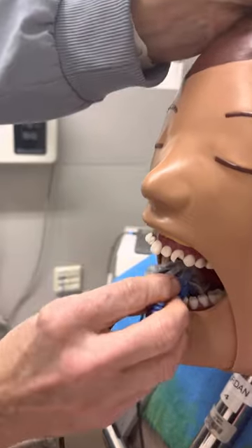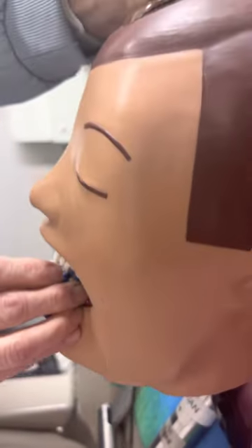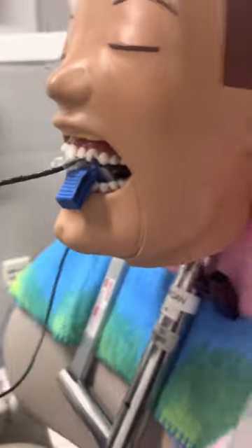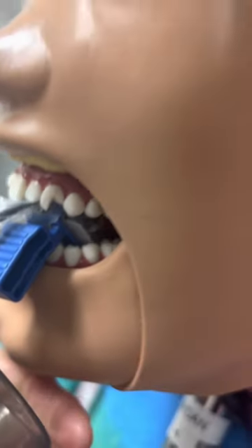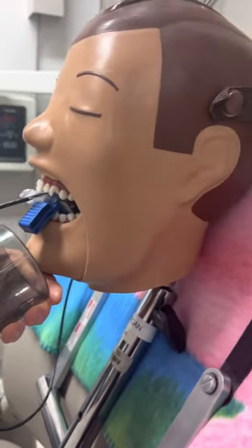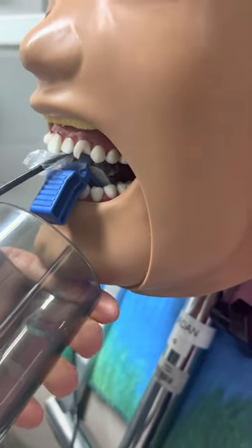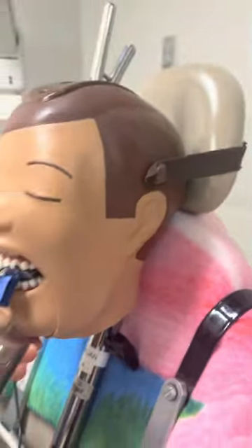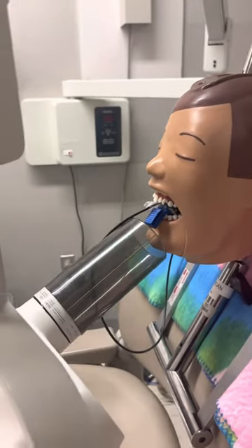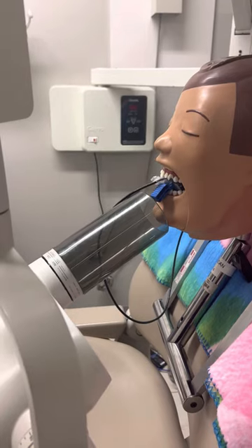We're going to tilt over for the canine lateral. Remember, we're right up against the teeth with this now because we're bisecting. When we were paralleling, we were in the center of the mouth. You can see where her sensor is — she's getting that cone right on there. That's your anteriors.